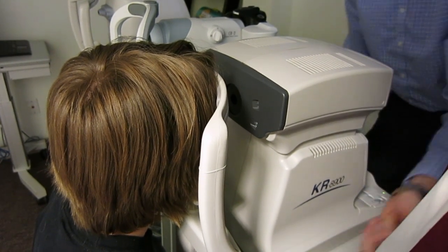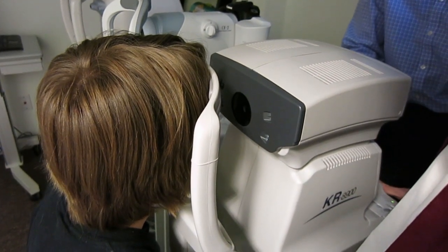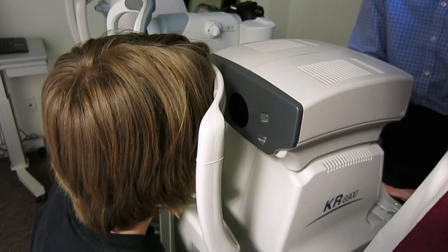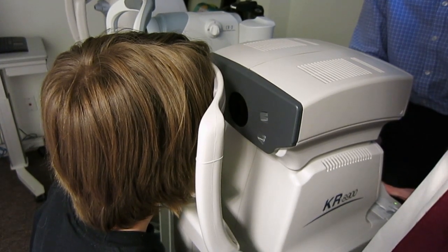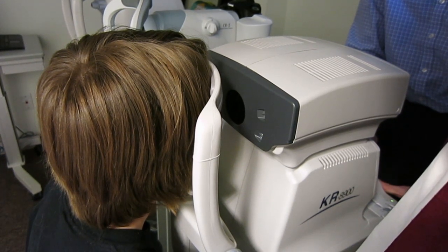So when we start this, you're going to see a farmhouse down at the end of the road and that's going to come in and out of focus. Do you see that farmhouse there? That'll get blurry and clear and blurry a couple of times — it'll just kind of do it on its own. You're doing great though.